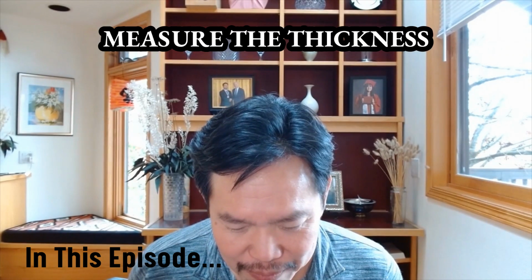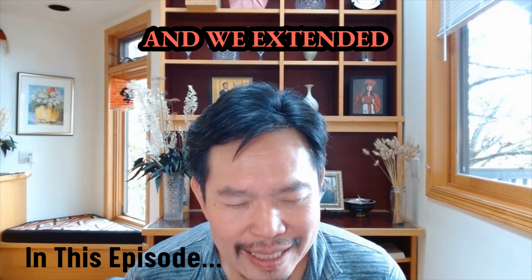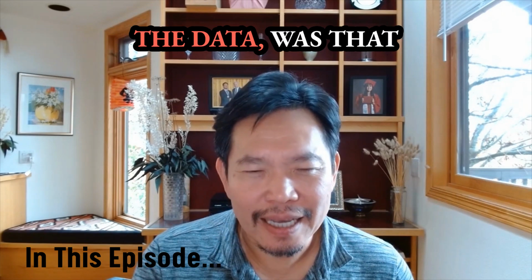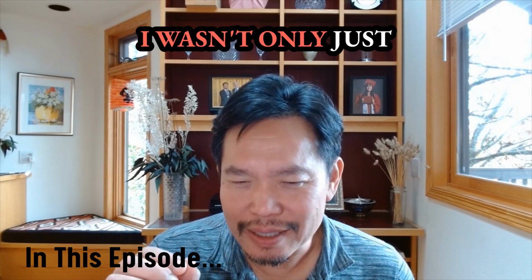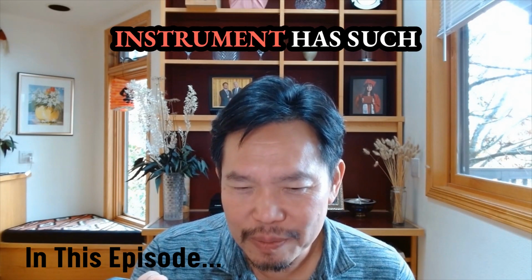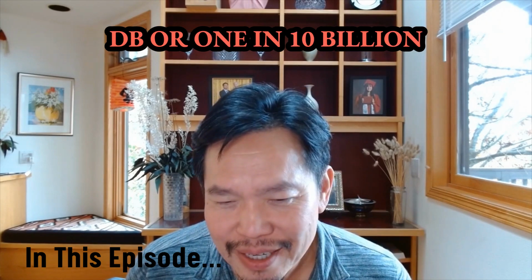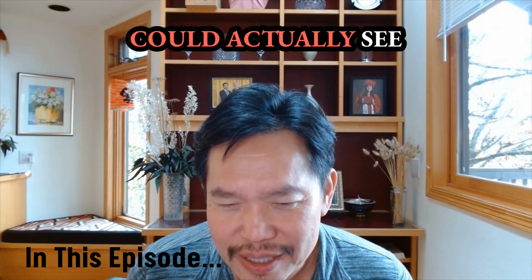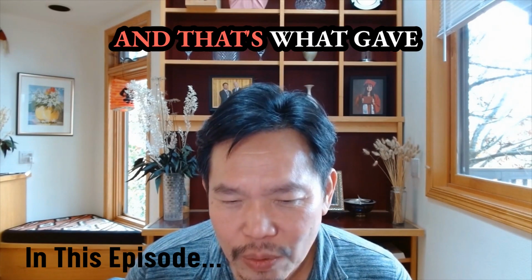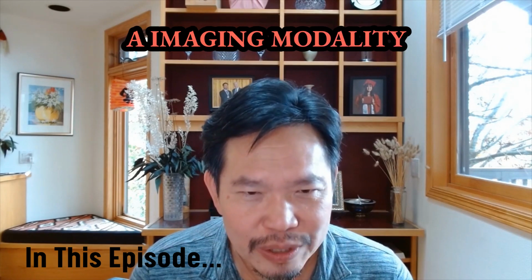My goal was to measure the thickness of tissue layers, and we extended that to measuring retinal thickness. What I realized from the data was that I wasn't only seeing the front and back surfaces of the retina, but the instrument has such high sensitivity, 100 dB or 1 in 10 billion sensitivity, that we could actually see internal structures inside the retina. And that's what gave me the idea that this could be turned into an imaging modality.